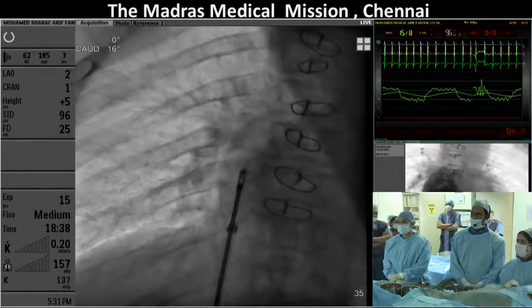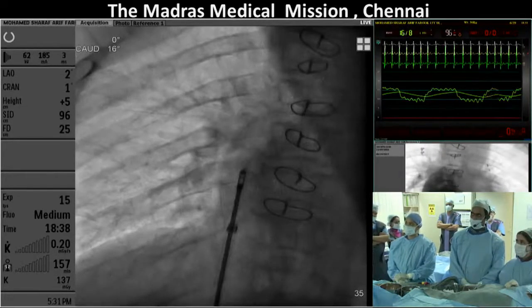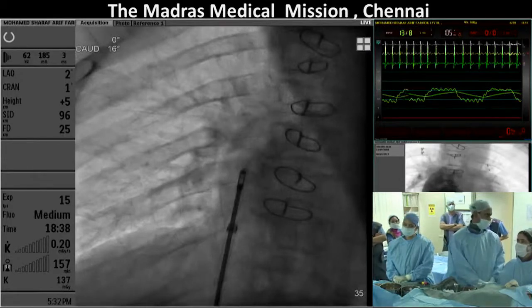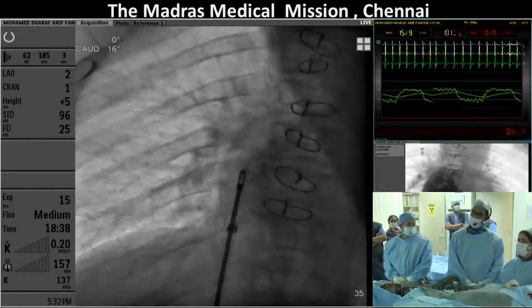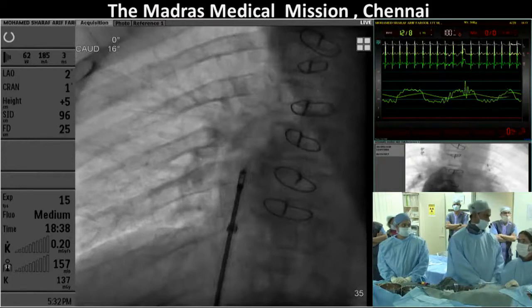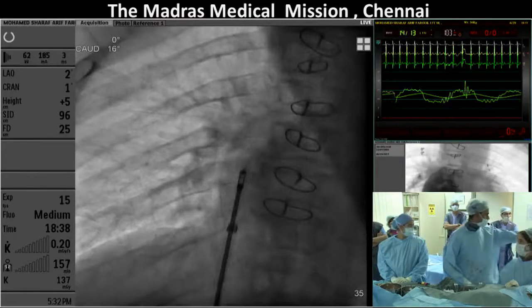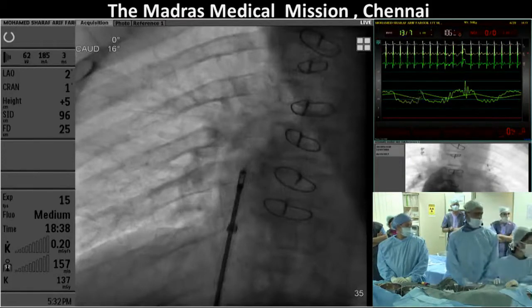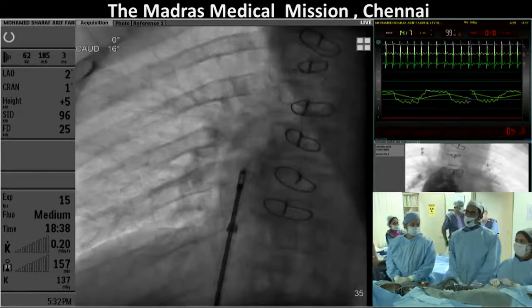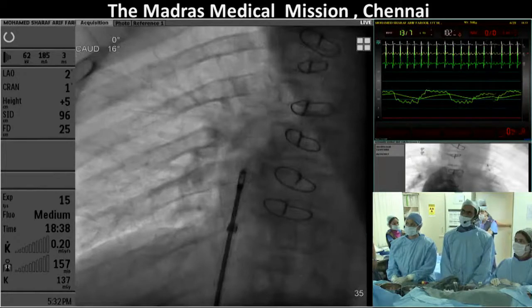I'm not surprised that the baffle pressure didn't go up, because the differences between too big and too small a hole are really quite small in this condition. Yeah. And I don't know that any of us here know what this baffle pressure will be a month from now or 6 months from now. But I don't think it'll be 13. I think it'll be higher than 13.